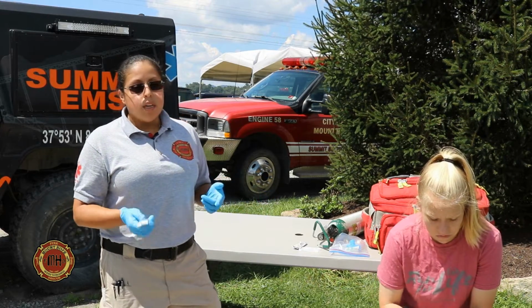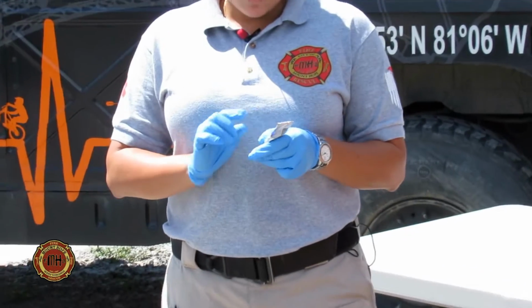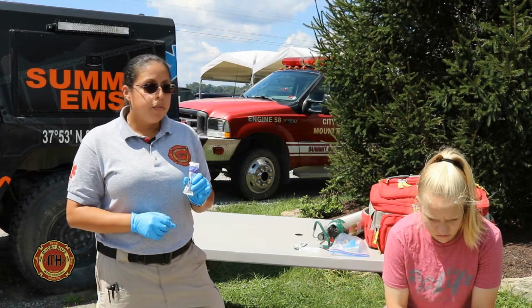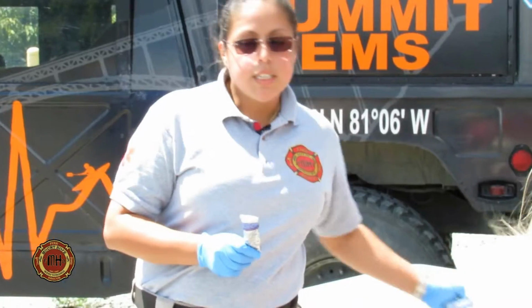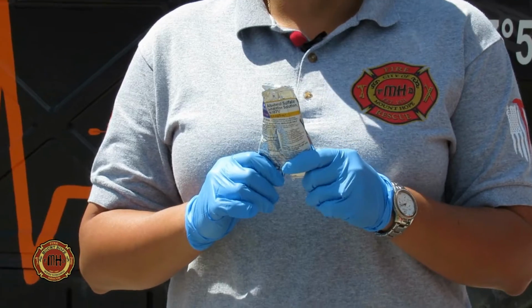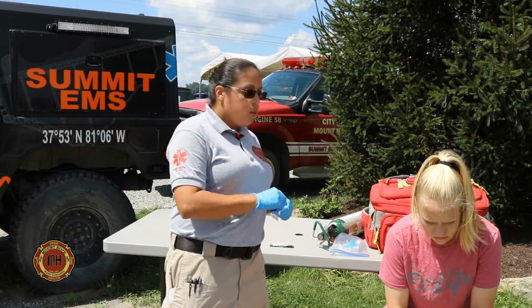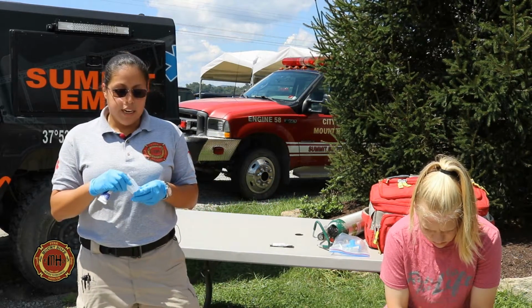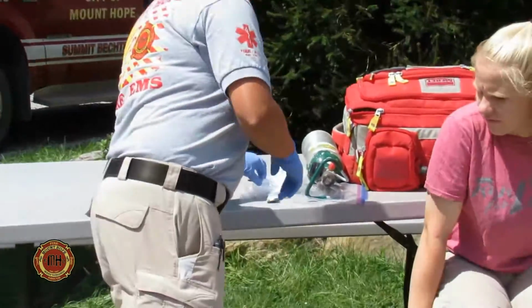So this comes in a couple of different ways. We have a duoneb, and that is your 0.5 milligrams of Atrovent and your 2.5 milligrams of albuterol. With this, because we need 5, we're going to need a secondary packet of just albuterol for the 2.5 milligrams to make that 5 of albuterol. If they're separate, then you'll need 2 of the 2.5 albuterol and 1 of the 0.5 Atrovent, and this creates a duoneb. So we're going to set up for this albuterol treatment.